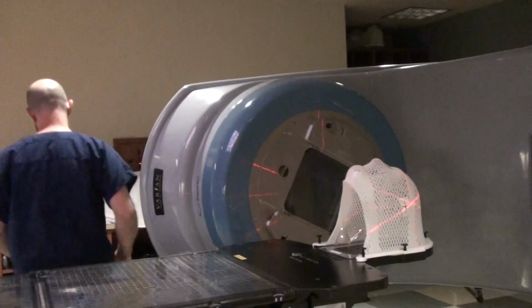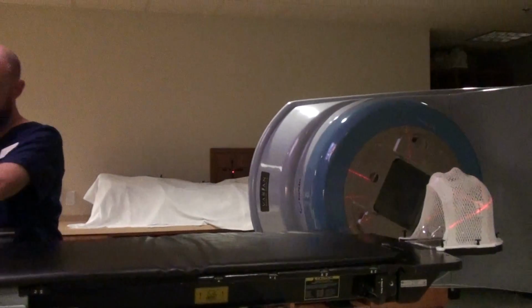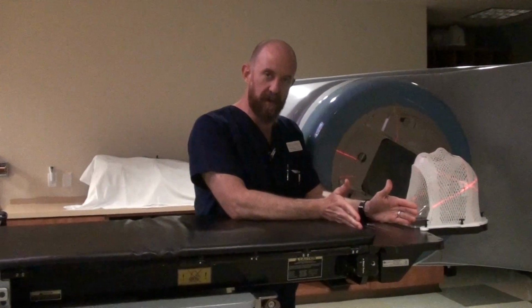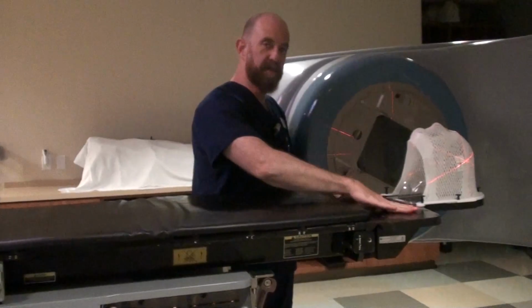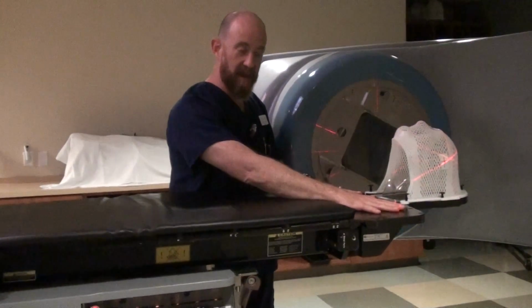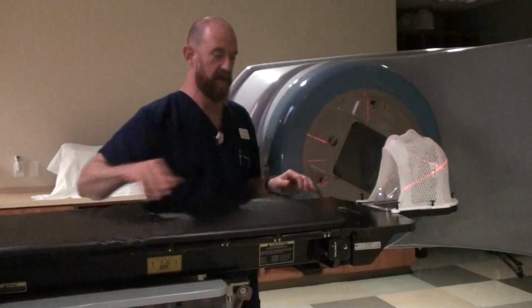If you have a table pad in place for your patient's comfort, that's great. But you want to keep it back far enough that you don't affect reproducibility here. So if you have the patients, basically kind of the tops of their shoulder blades will fit on the hard part of the table. That may not be as comfortable, but that's fine. We're looking to have reproducibility, not comfort.